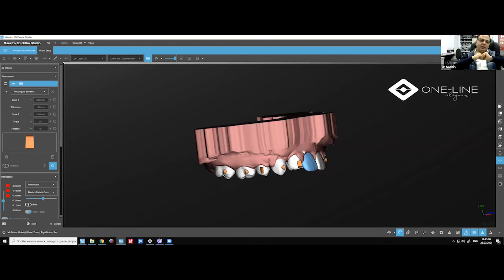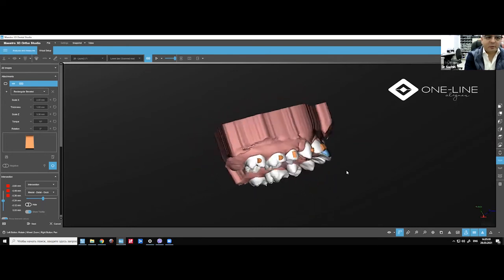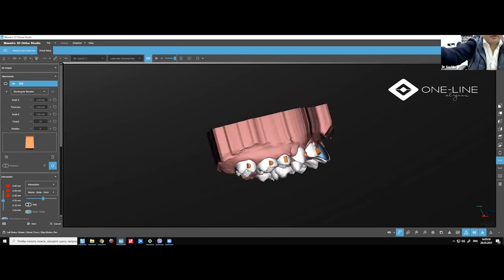So that will help us a lot to make the tracking very good for all the aligners. So this is what you can use in case you have a rotation, and then you have extrusion. I think it's clear why we do like that, right?